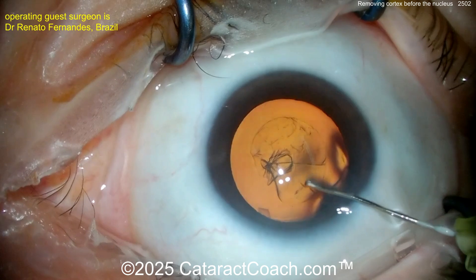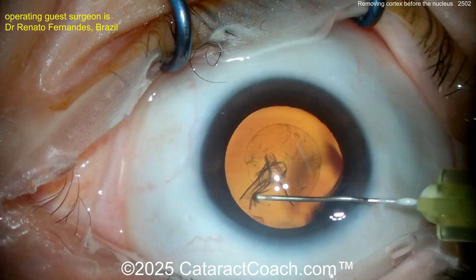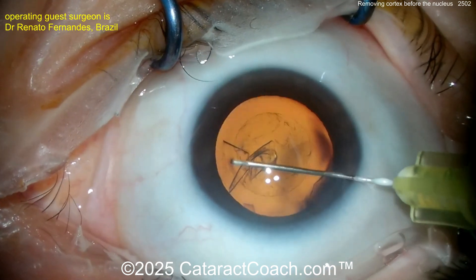Dr. Renato Fernandez from Brazil. Starting off with a nice-looking capsulorhexis, and that's going to go very smoothly in a case like this. There's going to be a lot of cortex because it's not a very dense nucleus.